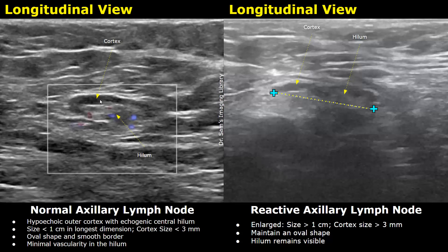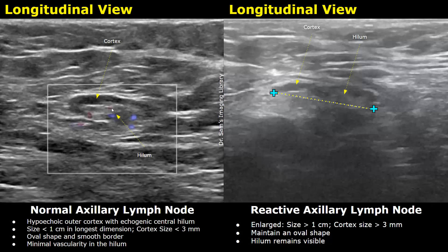The normal lymph node usually measures less than one centimeter in longest dimension, and its cortex size is usually less than three millimeters. The lymph node will have an oval shape and smooth border. On color Doppler, minimal vascularity in the hilum will be seen, with small Doppler signals indicating minimal vascularity in the lymph node.